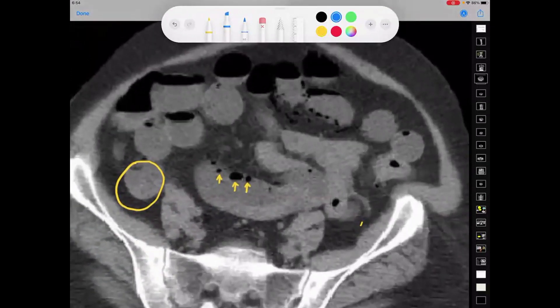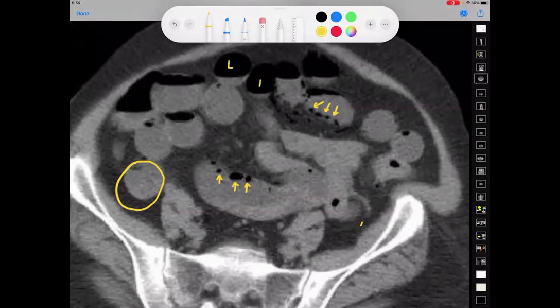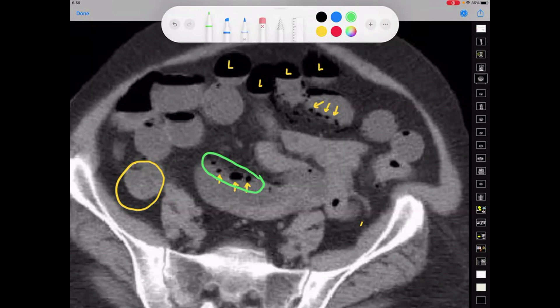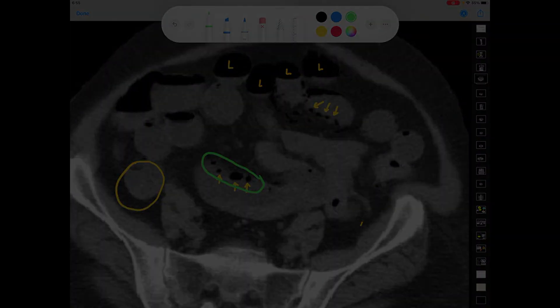I have drawn three yellow arrows here. What is happening to the wall of the intestine? They are forming gases. This is an intraluminal gas — identify an intraluminal gas. But you can appreciate that the gas I have marked is in the wall of the intestine. That means it is not well perfused; bacteria are going into the wall. This suggests an impending strangulation, if not already strangulated. For a surgeon, conservative therapy stops at this minute — you must go in.